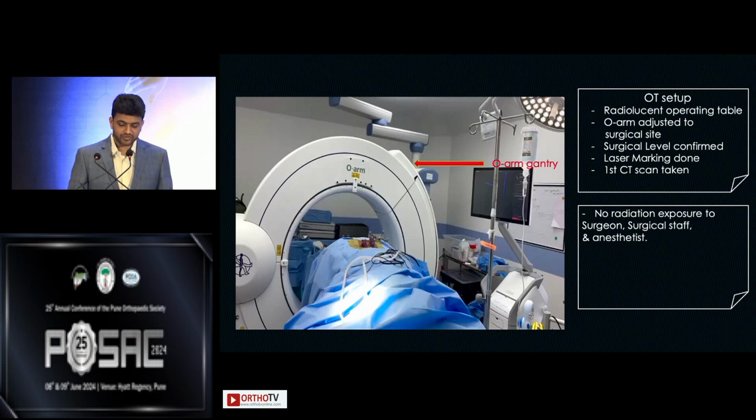This image shows the OT setup where we take the O-arm to the correct level, and levels are marked, laser marking is done with the O-arm. The first CT scan is taken. When the O-arm shots are taken, the surgeon, surgical staff as well as the anesthetist are not exposed to the radiation, reducing significant radiation exposure.